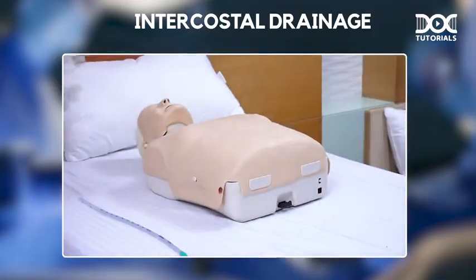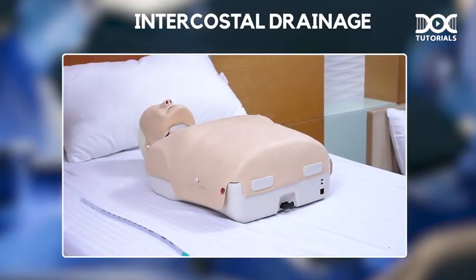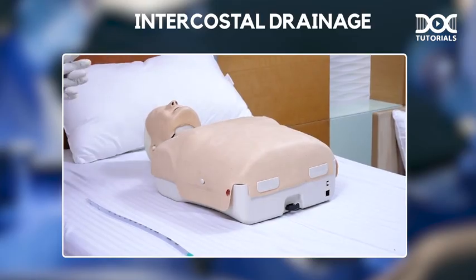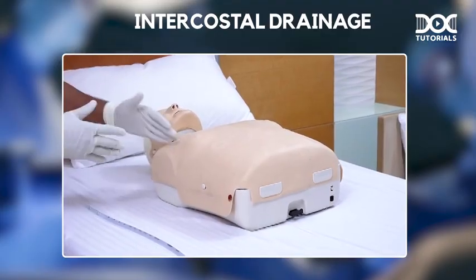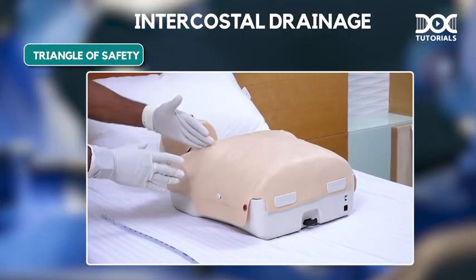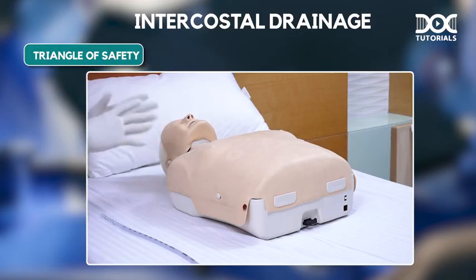Friends, next we are going to see one of the important videos, that is how to insert an intercostal drainage tube. This is a very important video. I have explained how to put the tube in this mannequin. Let me demonstrate. So you should know the triangle of safety, the lines you should not forget.